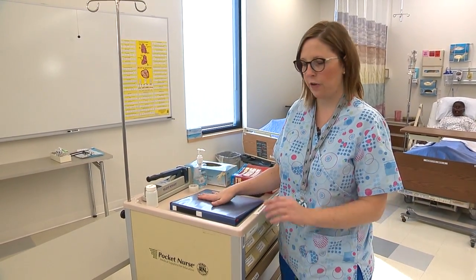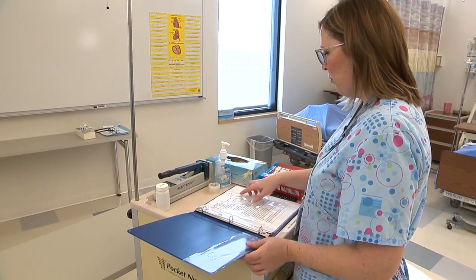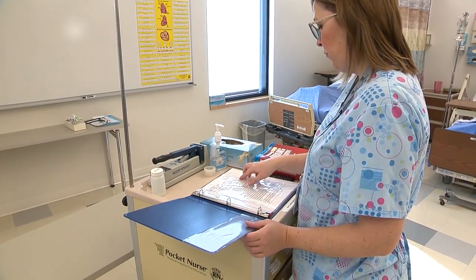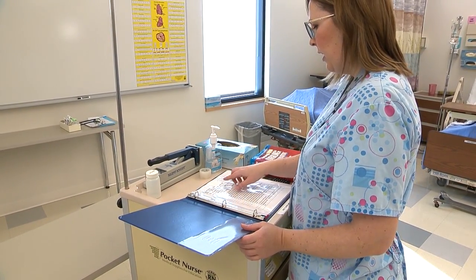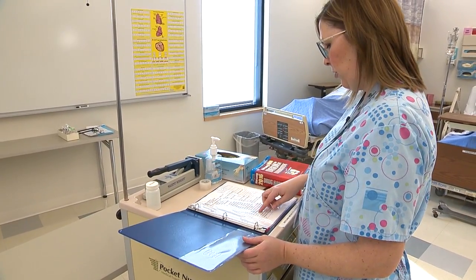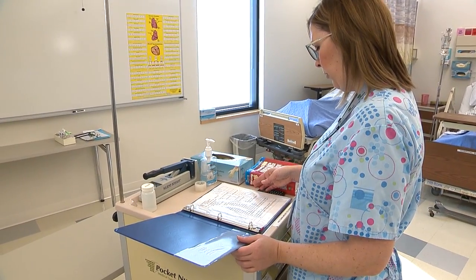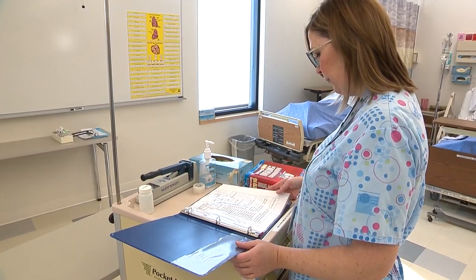I'm going to grab my patient's chart. We have Morgan Brown, MR number 5891351325, date of birth 8-4-70. He has no known allergies. There's an order here for morphine sulfate 2 milligrams IV push every three hours, PRN. I was told that he is experiencing some pain.